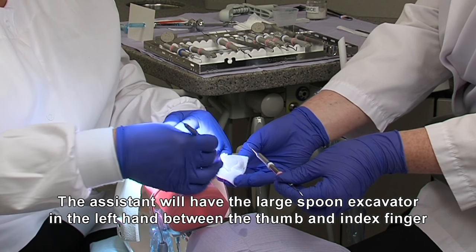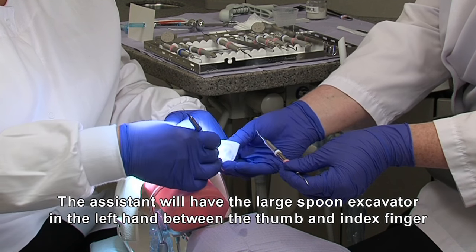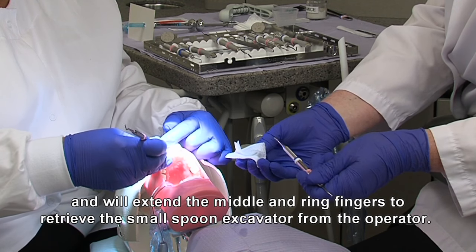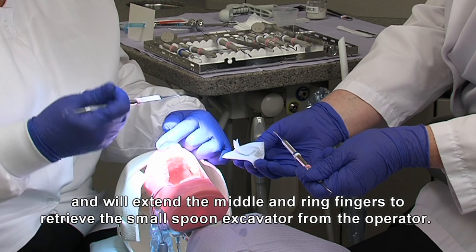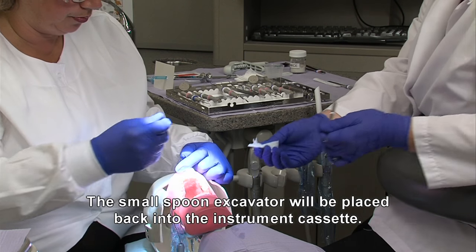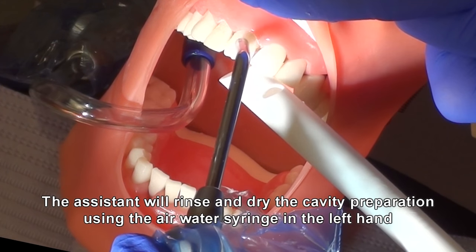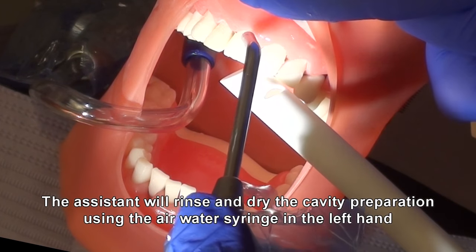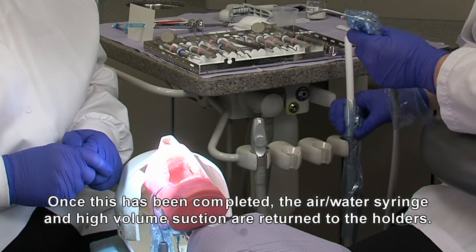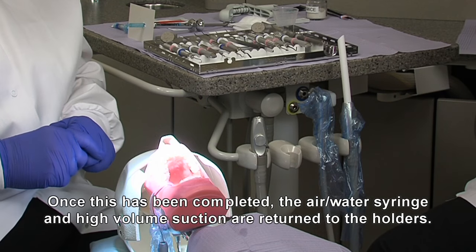The assistant will have the large spoon excavator in the left hand between the thumb and the index finger and will extend the middle and ring finger to retrieve the small spoon excavator from the operator. The small spoon excavator will be placed back into the instrument cassette. The assistant will rinse and dry the cavity preparation using the air-water syringe in the left hand and the high-volume suction in the right hand. Once this has been completed, the air-water syringe and high-volume suction are returned to the holders.